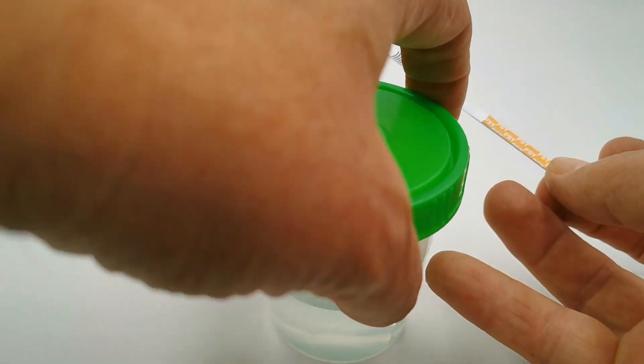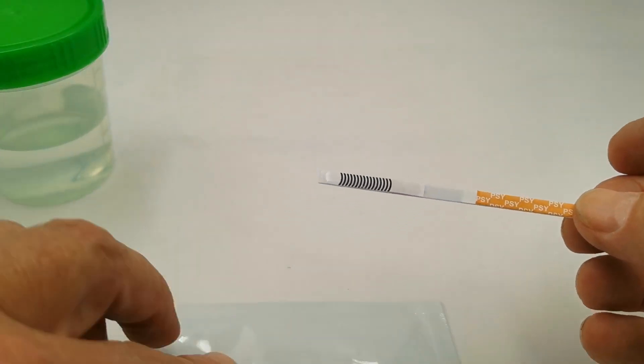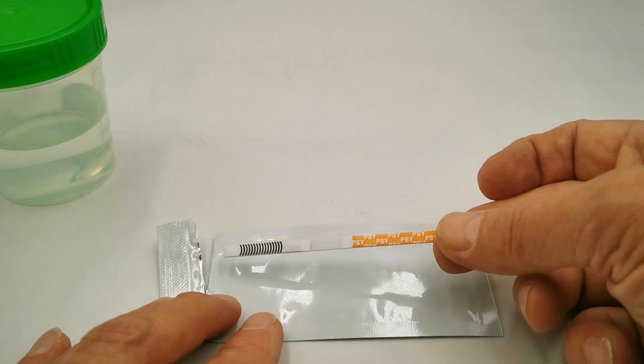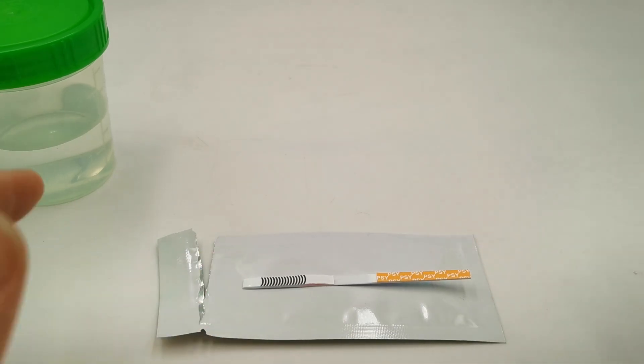Knock any excess sample off, remove the test strip from the sample and place it on a flat non-absorbent surface and start a timer to come back and read the test result at between 8 and 10 minutes.